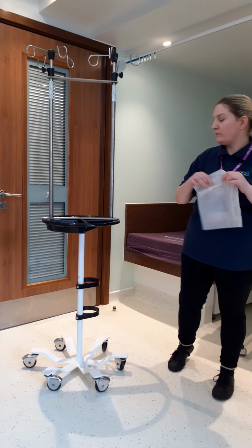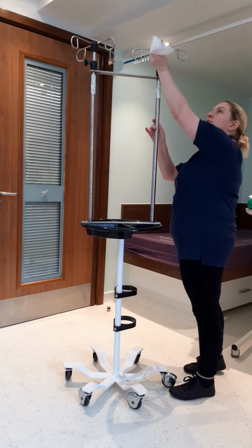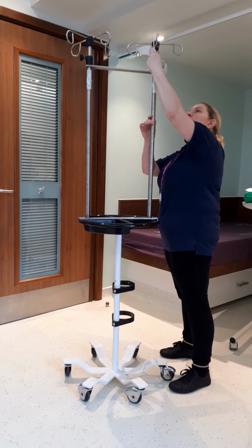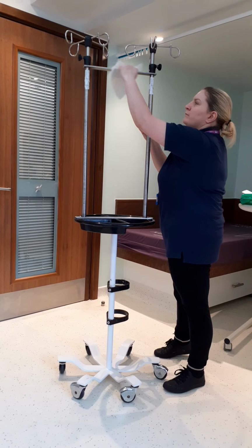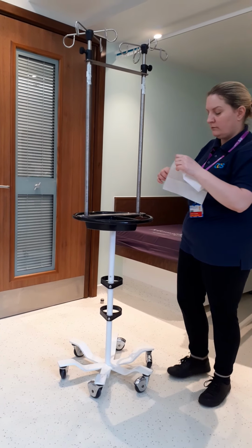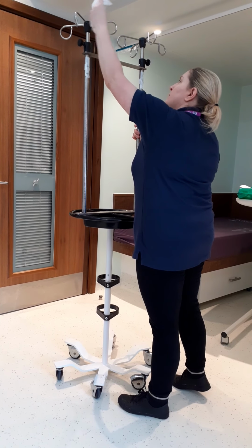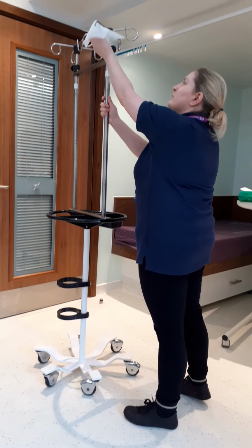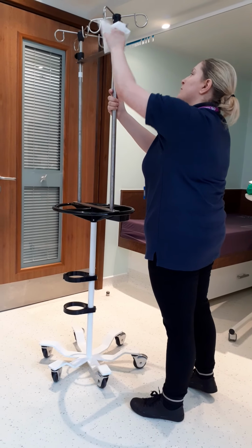So now that we have the drip stand with the equipment removed off it, we need to clean from the very top to the very bottom. This is because the very bottom is where the wheels are and are in contact with the floor and considered to be the most contaminated part of the drip stand. As you get further down the drip stand, you are likely to want to change your wipes more frequently as you're moving towards cleaning a more contaminated area.